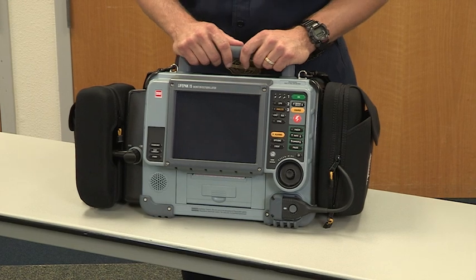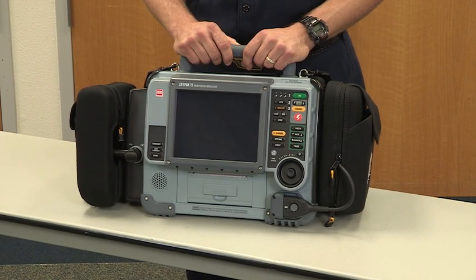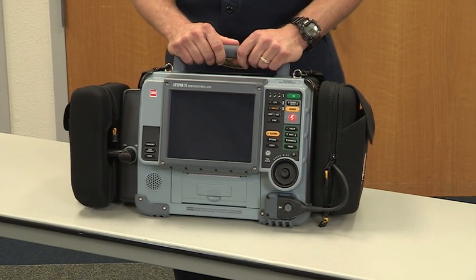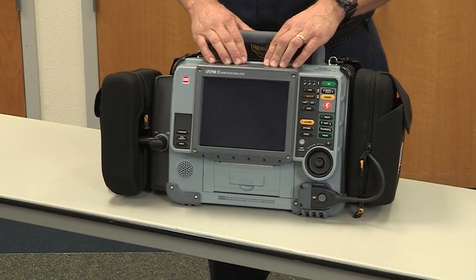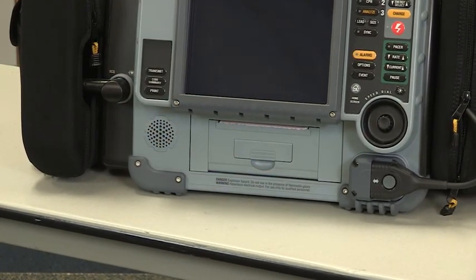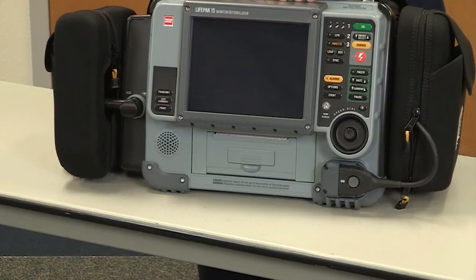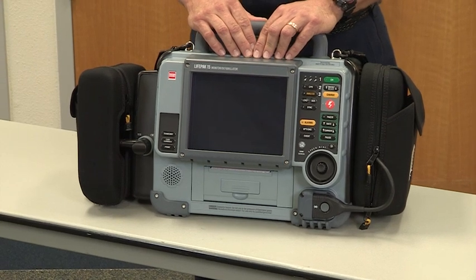Okay, now we're going to discuss the daily check. A lot of this is going to be review and redundant from the LIFEPAK 12. However, there are some differences with the LIFEPAK 15. Starting with the fact that the LIFEPAK 15 will do a self-test every day at 0300 and print out a report down here that says that the self-test passed. You'll find that every morning when you come out to do your rig check. Simply tear that off and put that with your user test on the clipboard in your sign-off sheet.